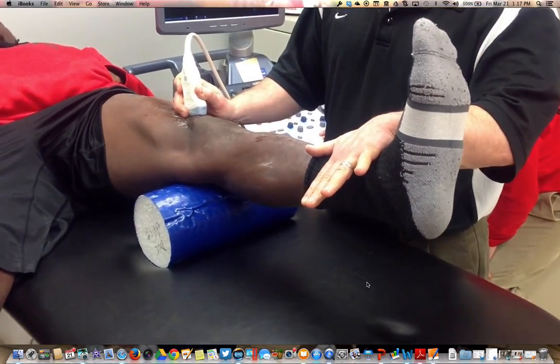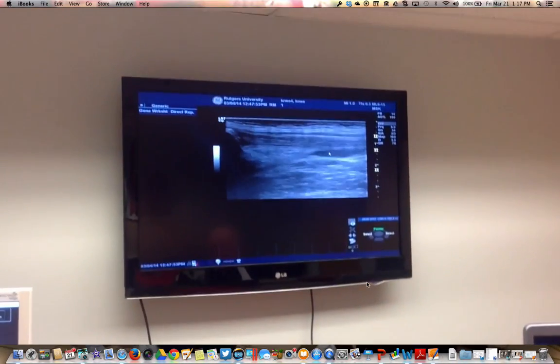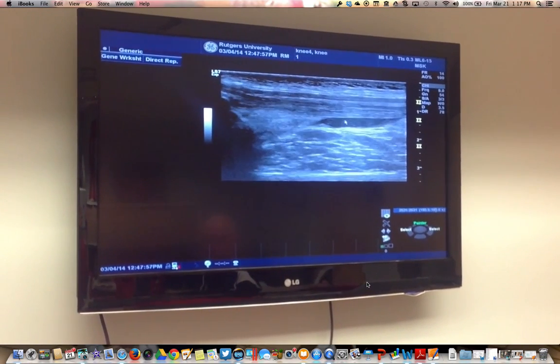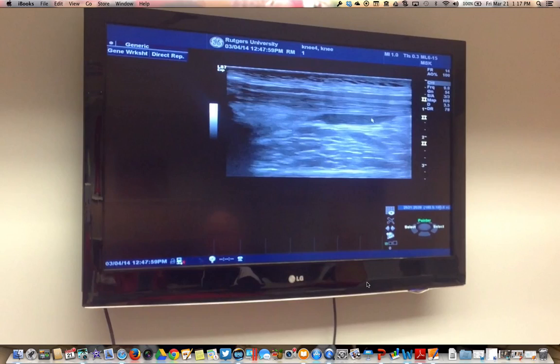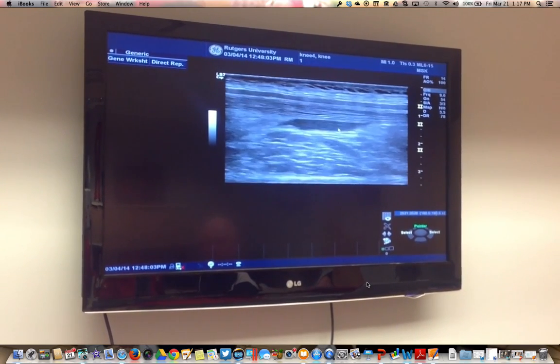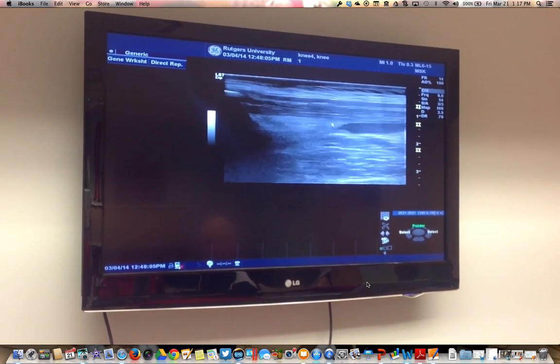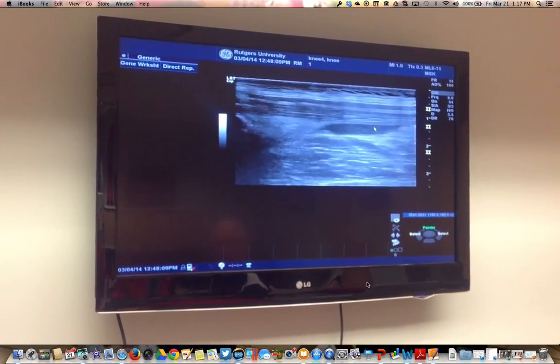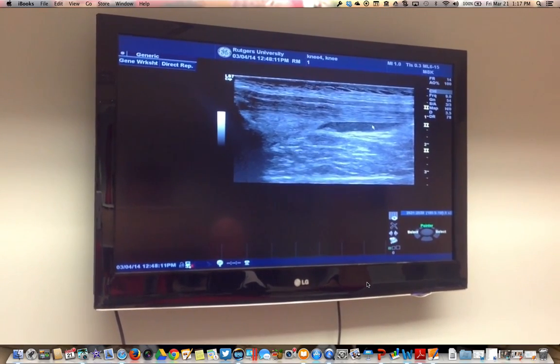And when he does that, we'll see that we enhance the fluid of the joint, and he has a small effusion. You should also note how far up that bursa or joint sac goes, fairly far up from its attachment down where the quad tendon goes into the patella. So, joint effusion right here. Relax.